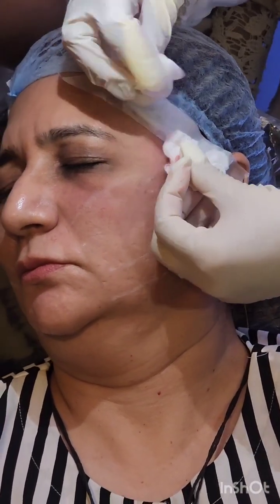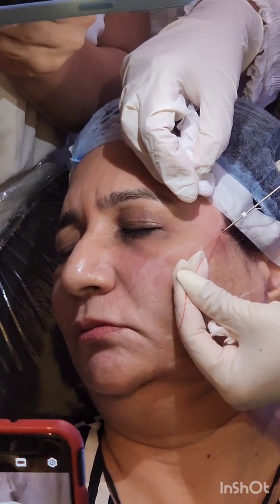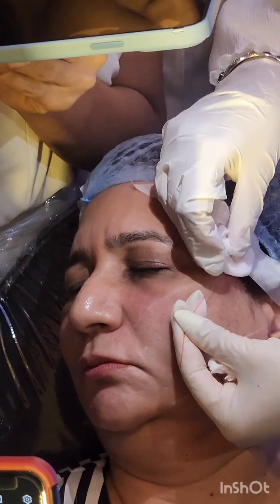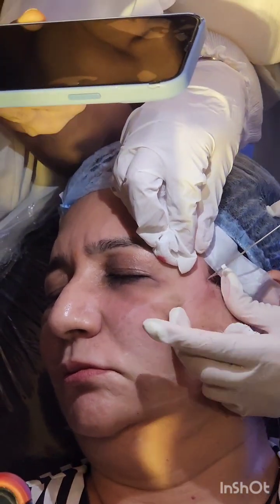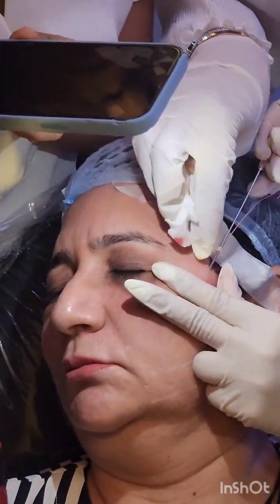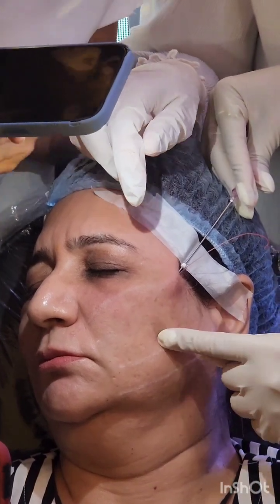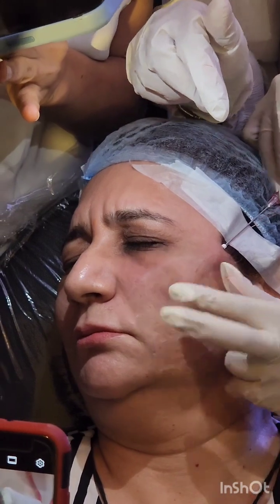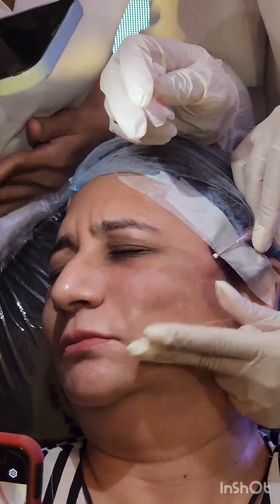So sometimes the second thread you'll find little difficulty, so pull the first thread and that will create the anchor. She has acne. So see, these are acne scarring, so that's why we were finding it difficult. Otherwise the technique was right, so don't worry. It is her skin which is making it little uncomfortable.